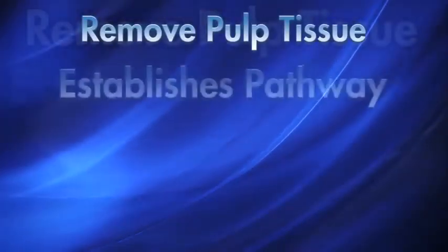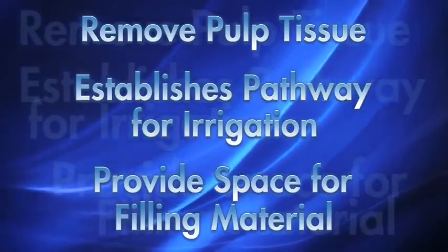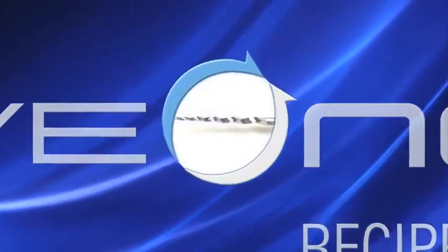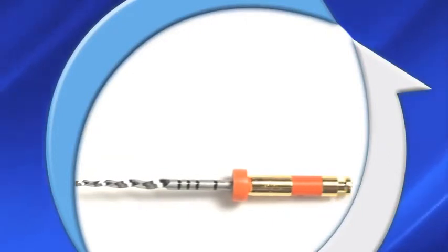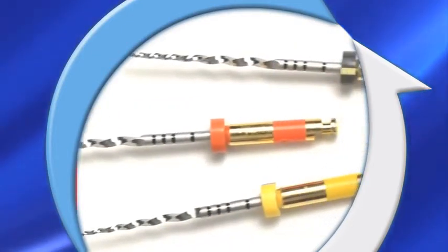Effective shaping of the root canal system is essential for achieving the objectives of endodontic treatment. This is Wave 1. The Wave 1 system is an extraordinary canal preparation technique. It relies on only one engine-driven instrument, which is used in a proprietary reciprocating motion and employs cutting-edge M-wire niti technology.